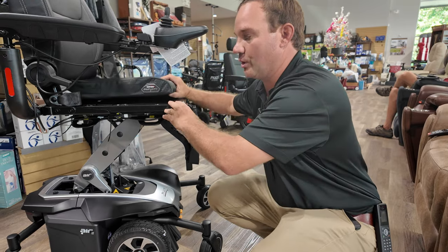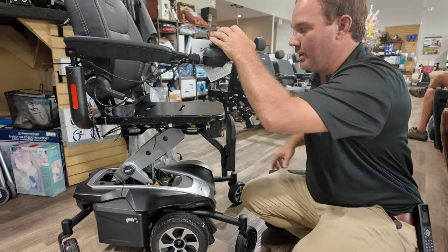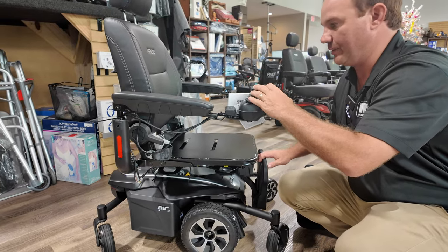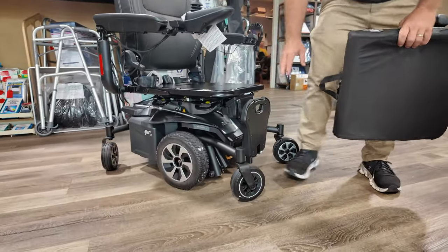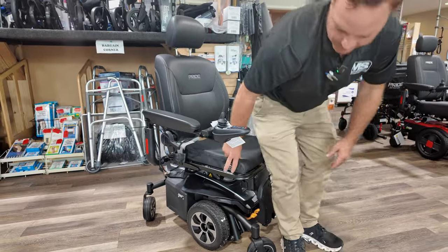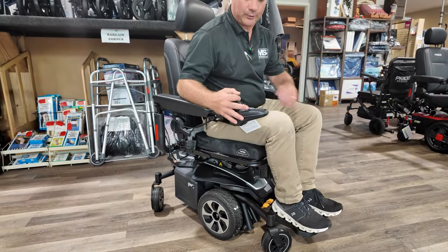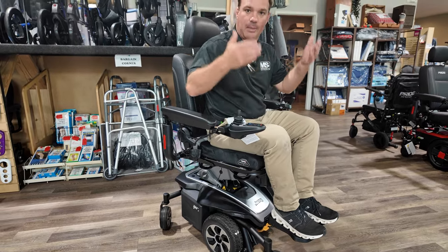Another reason you might go with the solid seat: if someone is shorter and needs the elevated seat, they can put a low-profile cushion in here since it's a lot lower to the ground than your standard contour seat. For shorter people this is a lot easier to get into. You can put the foot plate down and activate the seat up either through the joystick or through the control on the side.